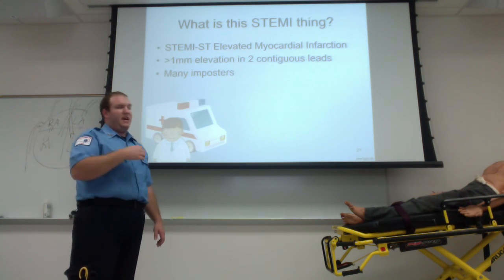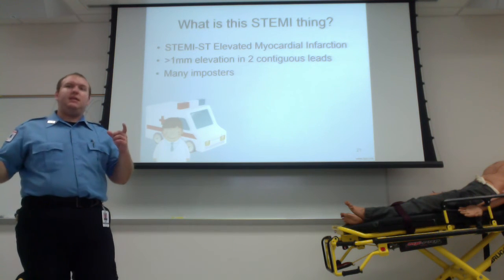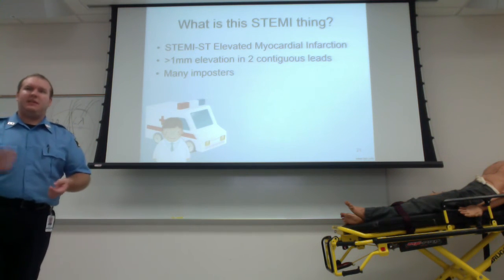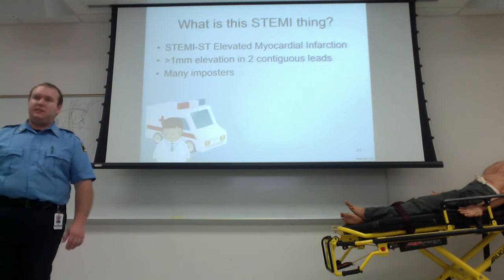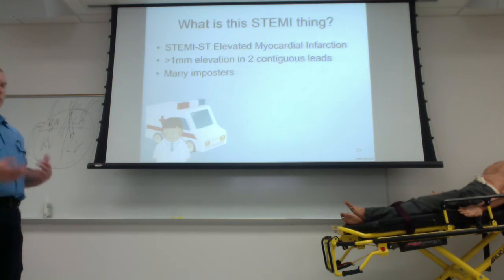And if you have a LifePak monitor, for example, it will actually give you a printout at the end of your 12 lead and tell you how much elevation is in each of those ST segments. Pretty cool thing. I'm used to both the LifePak and the Zoll. That's one thing I really like about the LifePak better. But it's just whatever your service carries. I want to say there is actually a way to set it up on the Zoll. We don't have them where I work.